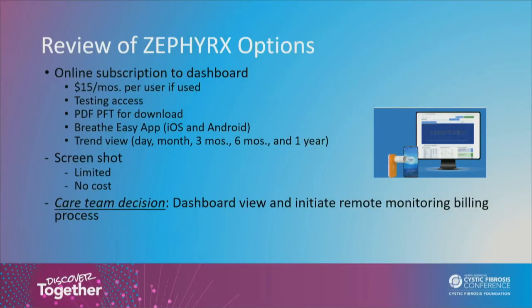Obviously, we did opt in for the dashboard, and we always decided that we were going to do this because we thought that we absolutely needed to have the PDF version of the testing. We needed to be able to get in and reject the poor tests and select the best test. If we had no best tests, then RT was very quick to contact them to redo a setup or redo a training if that was necessary, because we were all remote during that time in which this was implemented.